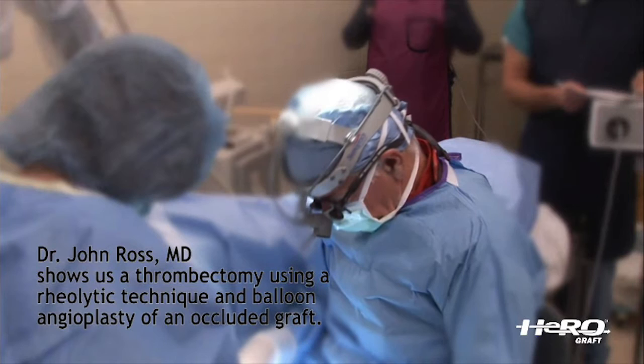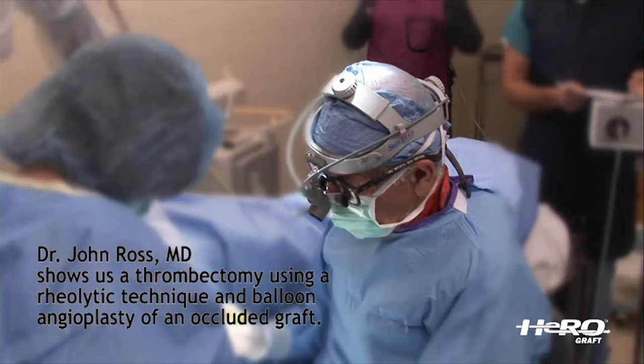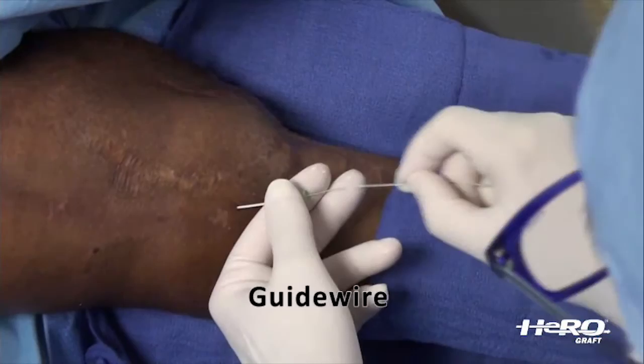The thrombectomy device should not have any mechanically moving or circulating parts to avoid internal damage to the outflow component. Devices used to declot HeRO should be 90 centimeters in length. The device must accommodate the full length of HeRO. Fluoroscopy is used throughout the procedure to visualize the outflow component tip and device connector. Contrast can be injected to verify patency.